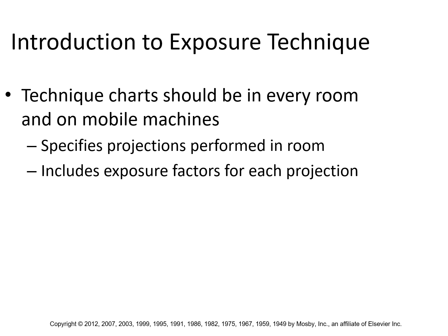Now in your senior year, I'll actually teach you the method for making a technique chart should you want to. Okay, it's required, but no one goes to because the APR exists. Most people just say, well, the APR is essentially a technique chart. Now, if the APR is not properly calibrated upon installation, well, then it's a worthless technique chart.